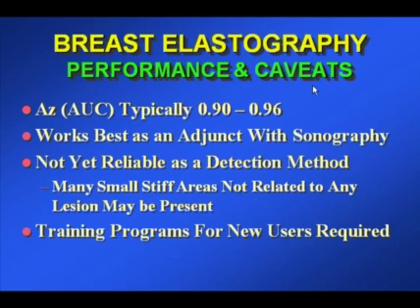As you could see from the previous elastograms that I showed, there are many dark areas on an elastogram that could represent cancers, but don't, because you don't see a lesion corresponding to that area on the sonogram. So it's much more useful as an adjunct where you detect the lesion using sonography and then try to evaluate whether the lesion is suspicious for benign or malignant using elastography.